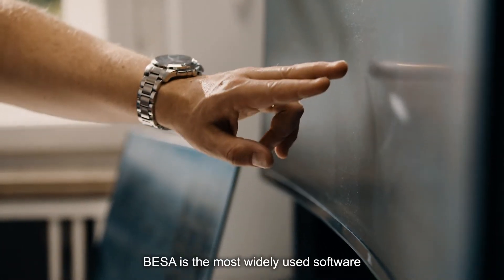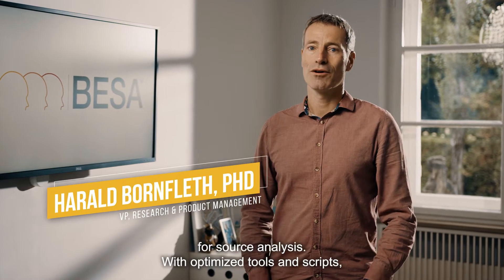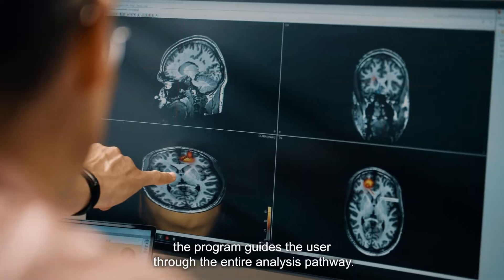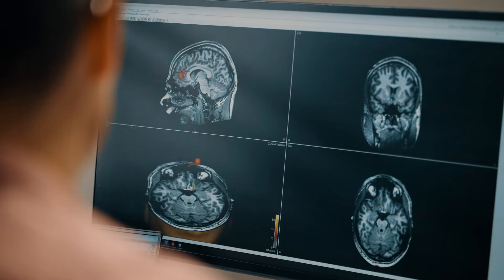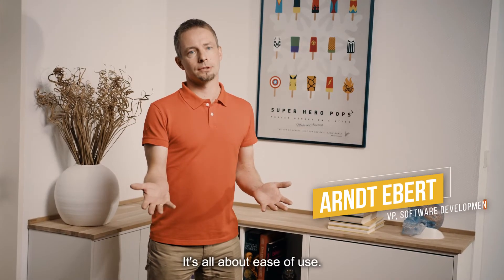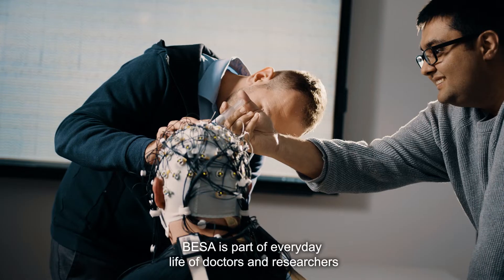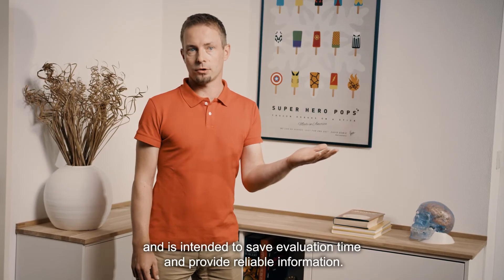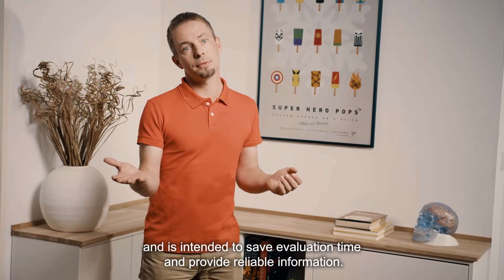Besa is the most widely used software for source analysis. With optimized tools and scripts, the program guides the user through the entire analysis pathway. It's all about ease of use. Besa is part of everyday life of doctors and researchers and is intended to save evaluation time and provide reliable information.